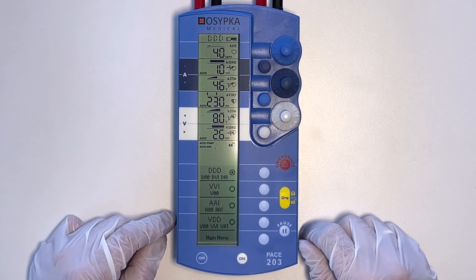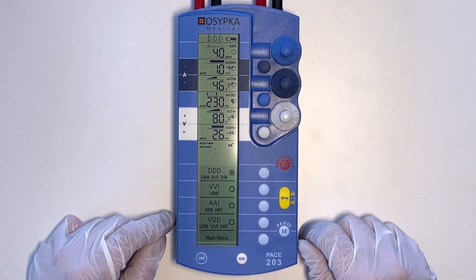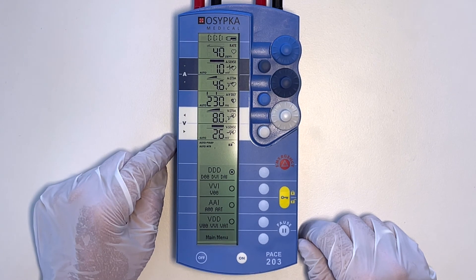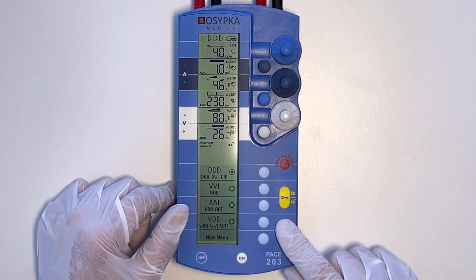If the pause button is pressed for more than 10 seconds, the device ignores the pause function for safety reasons and automatically reverts to stimulation mode. In order to carry out another measurement, the pause key must be pressed again.